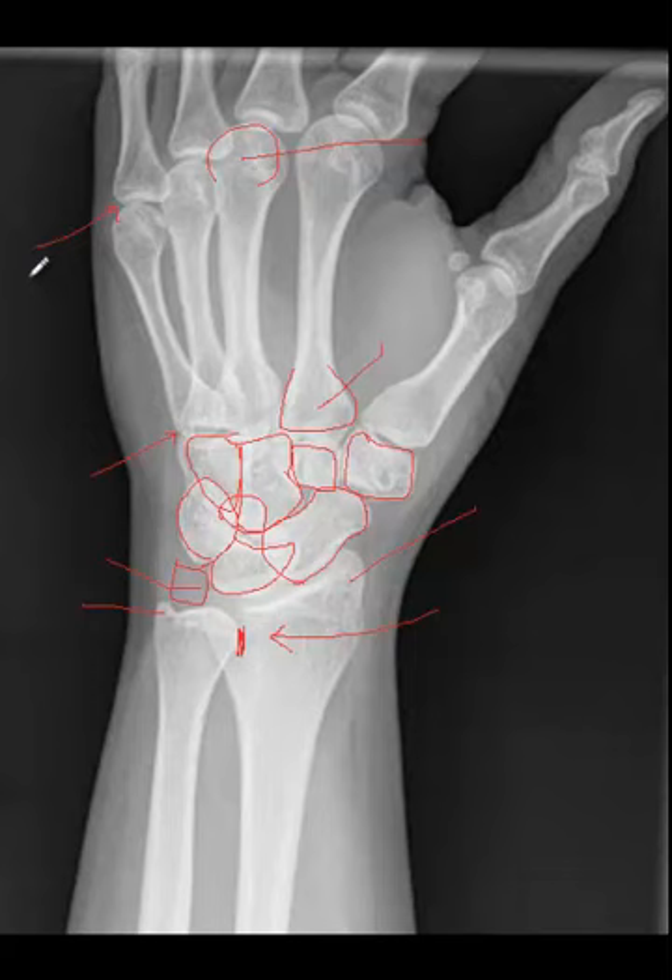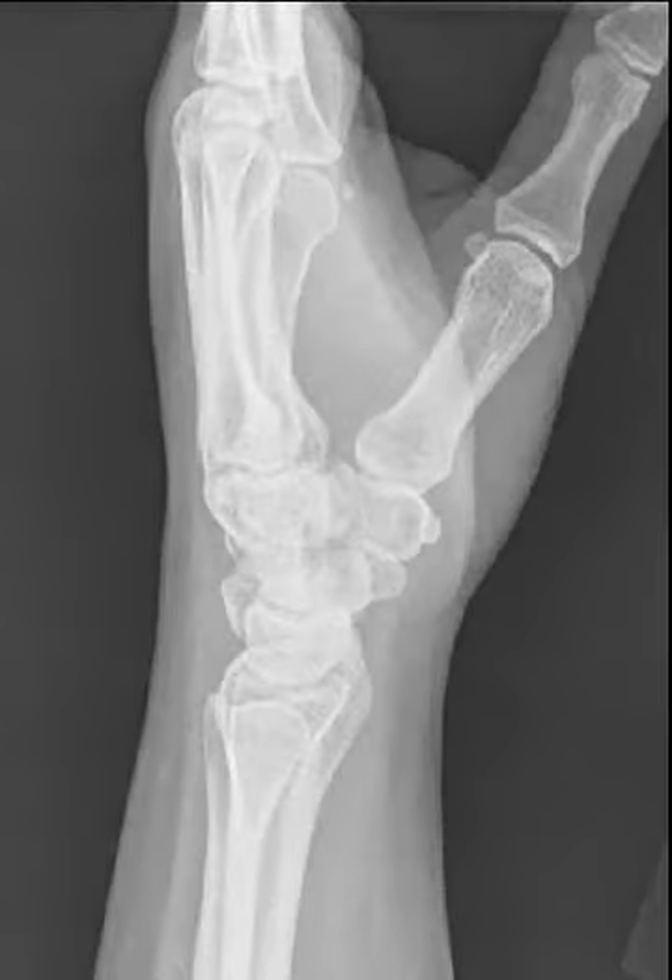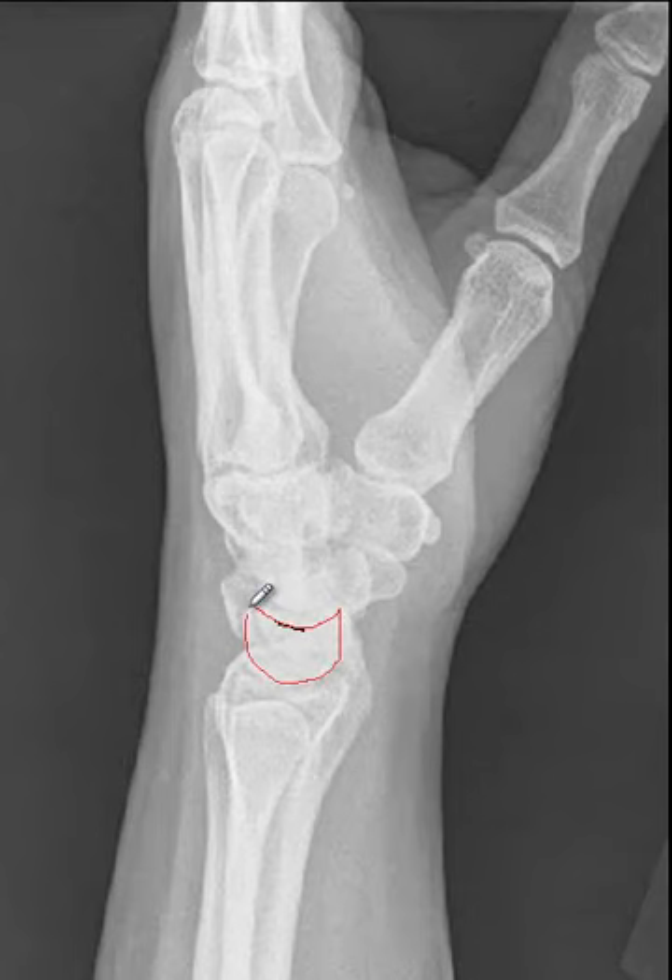Let's move on to the lateral projection of the wrist. Similar to the oblique projections, the carpals are really going to be the challenge here. The most important thing to remember is that you're not going to see a full carpal without superimposition of other carpals. I like to start with the proximal row and evaluate the lunate, which is easily identified because it is shaped like a crescent moon on the lateral projection. Here is the lunate. The bone that sits directly on top of the lunate is always going to be the capitate. You can see a portion of the scaphoid — what's sticking out in front like the little nose of a dog is the scaphoid. Back here you can see a portion of the triquetrum.